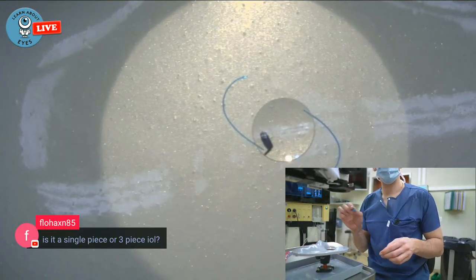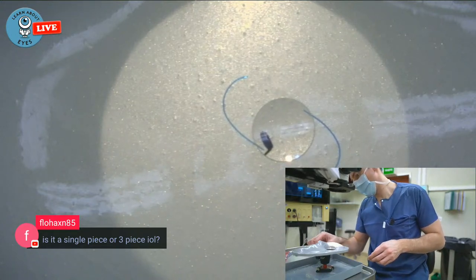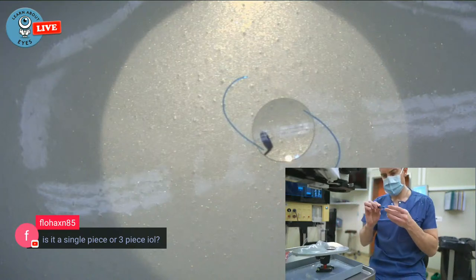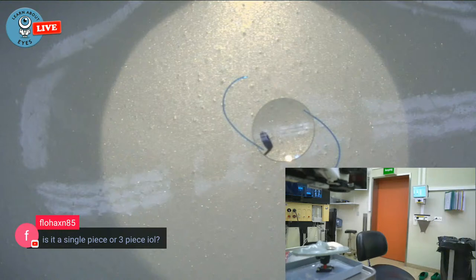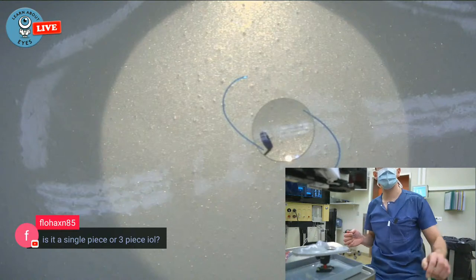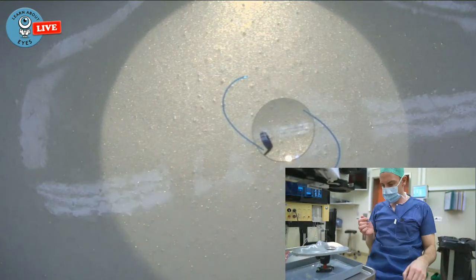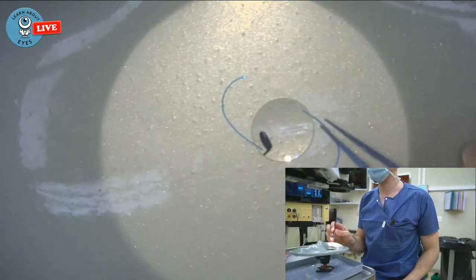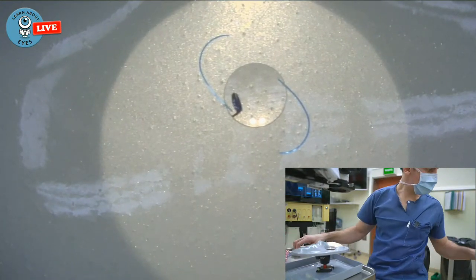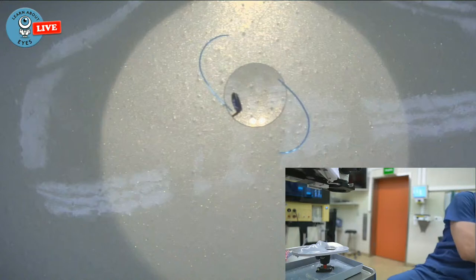These instruments, they do get really dirty when you use Visco. So you need to sometimes clean it because it gets hard and then sticky, super sticky. Maybe with some scissors. All right, now I just had an idea.